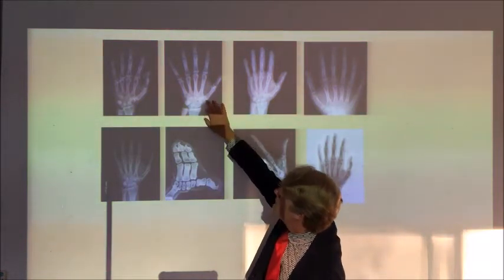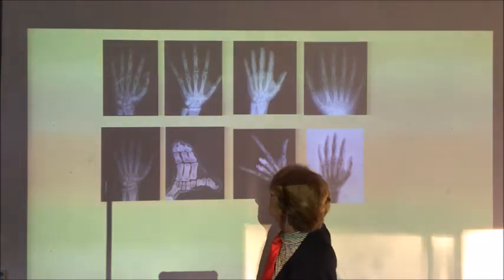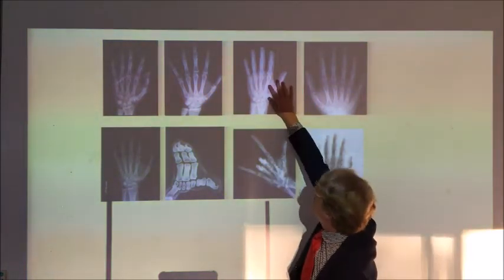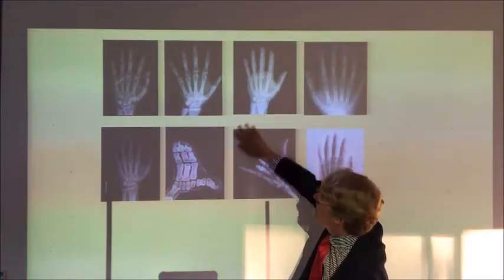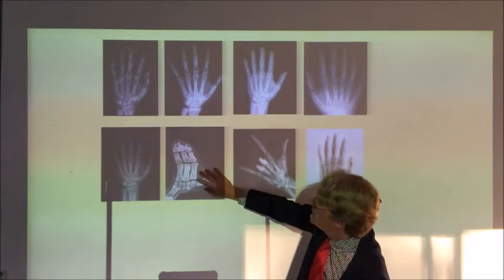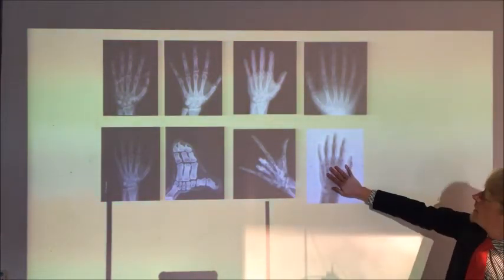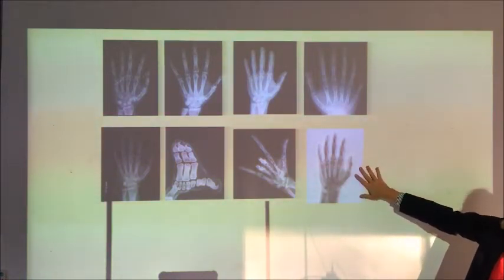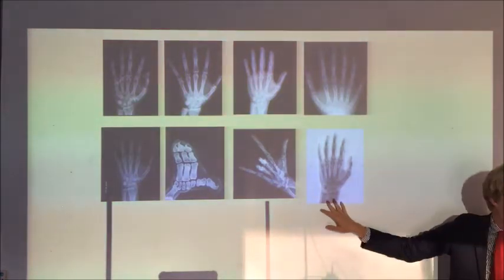So the contrast on this image is clear because this is very white and this is very dark. In terms of sharpness, I'd say this is slightly softer on the edges here. I would say this is a sharper image, and say this one over here where I can see very clear lines. Okay, this one is in negative, by the way, so that's slightly different. You might take a moment to look at them closely and see if you can figure out where they're from or what's odd about them.